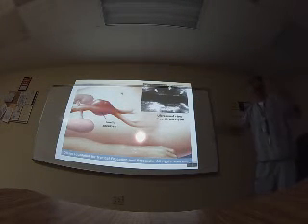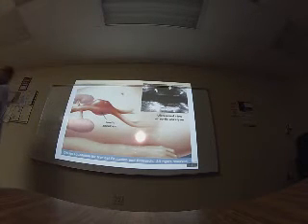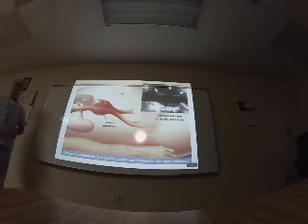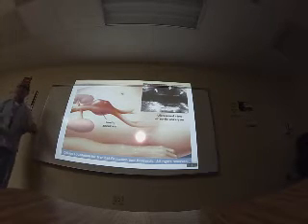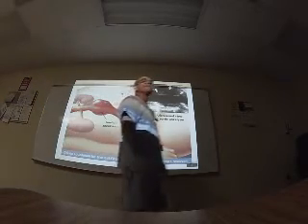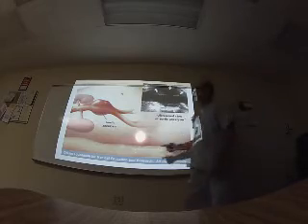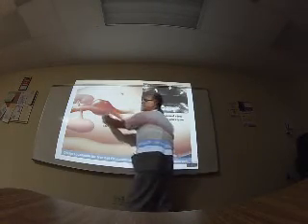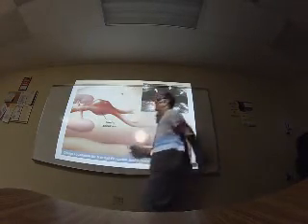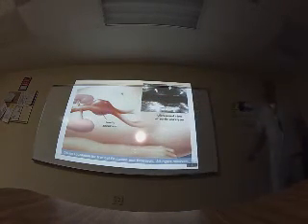This is something that you scan a lot of the time, not to make the diagnosis, but to know the following. When the aneurysm is more than 6 centimeters, it's very dangerous. The person cannot go home; they must go immediately to the hospital for surgery. Very bad. 6 centimeters is the maximum acceptable diameter of an abdominal aneurysm. You can see this abdominal aneurysm is infrarenal, below the renal arteries, inferior to the renal arteries. This is the good one.